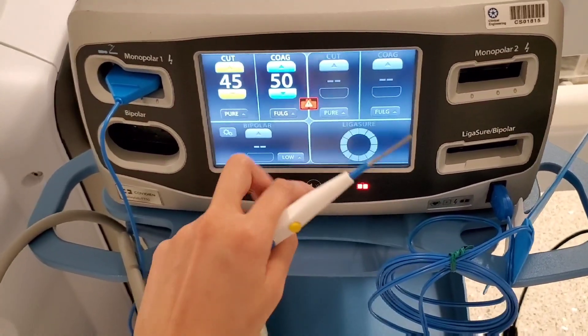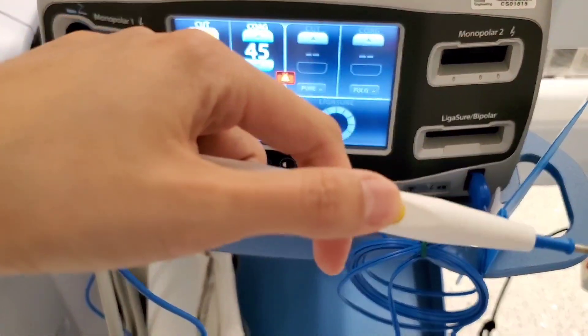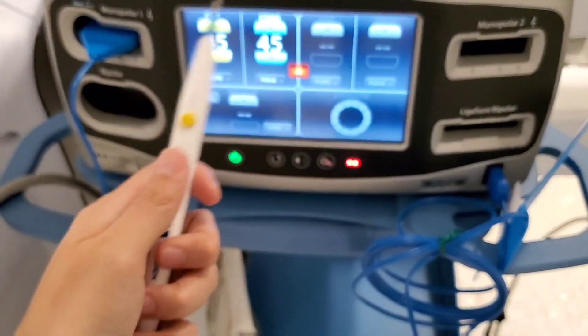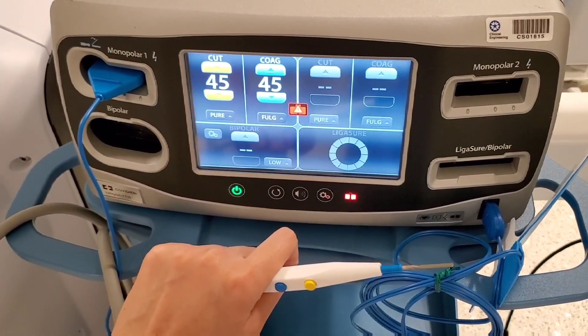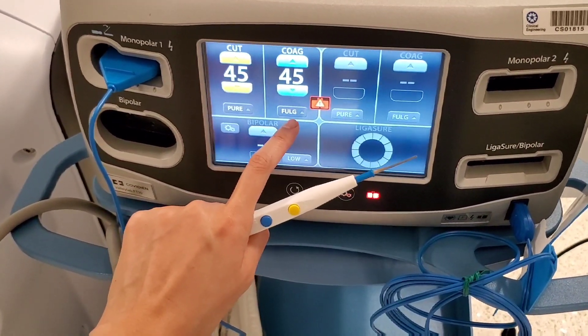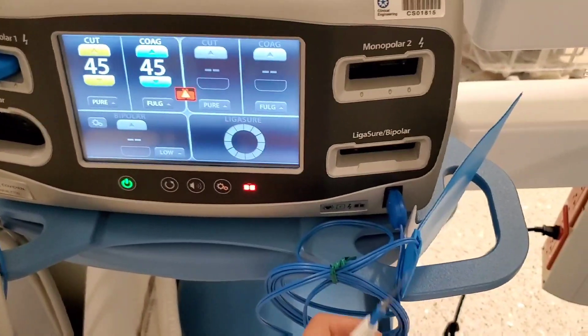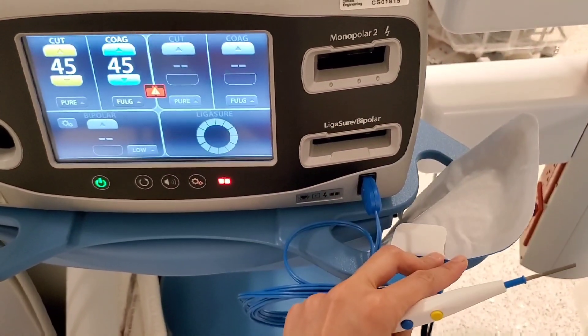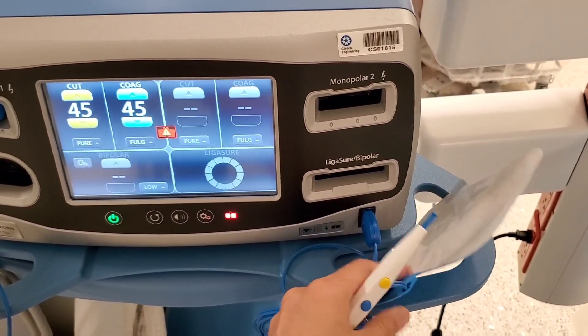So just a recap: this is a bovie pencil. This is cut, this is coag. It goes to the monopolar and then you have to adjust it to the surgeon's preference. Pure and fulguration — that depends on the surgeon's preference but it's always like this. Again, you cannot use this unless you have a bovie pad that is securely and nicely attached to the patient, flat on a meaty area.